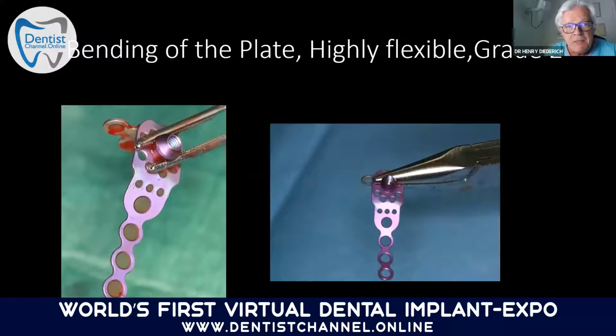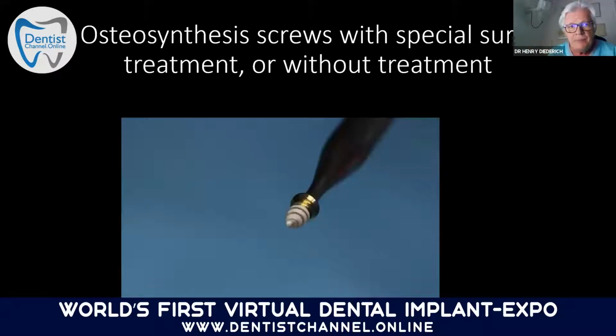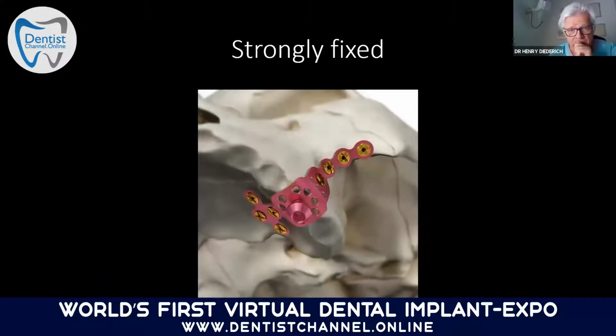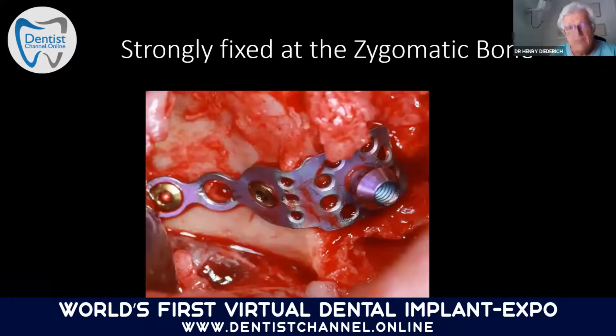The specificity of these plates, they're highly flexible, they're in grade 2. And then you see, you adapt them always to the individual situation of the bone of our patient. They are fixed with screws. You may have screws with special surface treatment, and also the plates are treated on surface. And here you see, they are strongly fixed, one part in the zygomatic bone and the other part on the palate. And here is the real skull, how it works in reality.